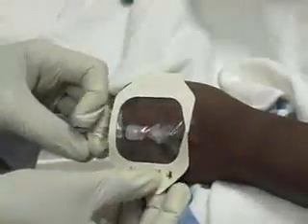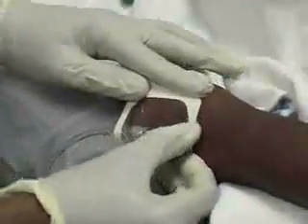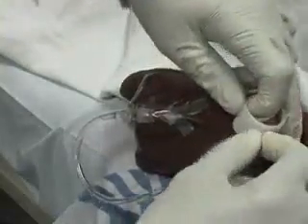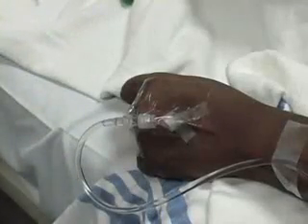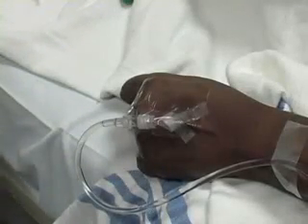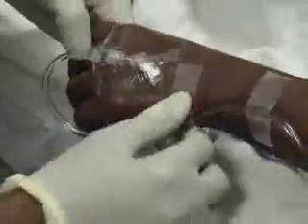Tegaderm should be placed over the hub and catheter entry site to keep the skin clean and dry. When placing a catheter in the hand, loop the tubing away from the insertion site and secure the tubing to the patient's wrist and forearm. This decreases the amount of tension placed on the IV and will help to prevent the catheter from being dislodged.